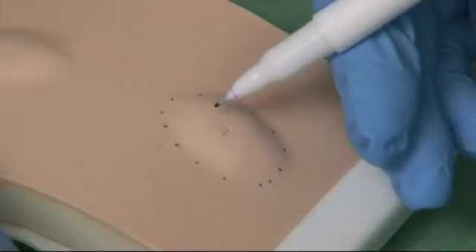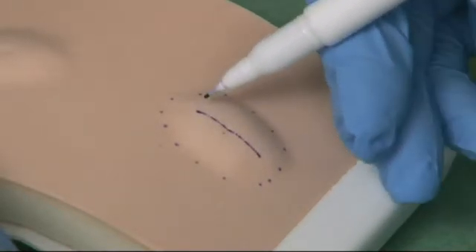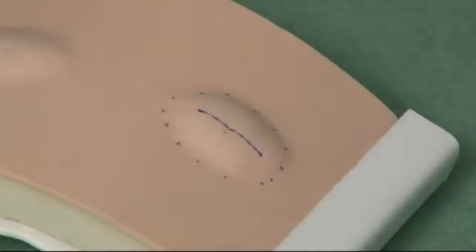Next, mark your incision over the top of the lipoma. There's no need to excise any skin with a lipoma, as it is entirely subcutaneous and therefore not fixed to the skin.